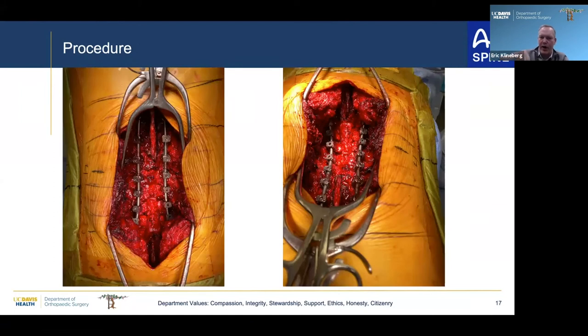And when you hook them into the pelvis, you can really anteverT that pelvis nicely when you grab onto the ilium and drive those rods forward with that cantilever maneuver. And that really helps you achieve that low lumbar lordosis where you need it the most.